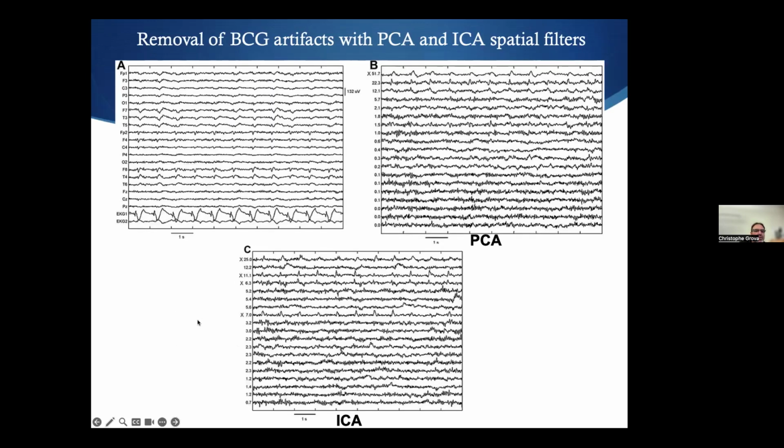And in your ICA, what you see is that this component, this component, this component, and this component is clearly seeing this repetitive rhythmic pattern. So it looks like it was not only one basic component, it was a little bit more, and you can remove those. And this is actually working nicely. Usually, one of the standard techniques we are using is we first use AAS, or OBS, so we first remove most of the artifact. We look at those, and when we realize, looking visually, that it's not so difficult because you see the repetitive pattern, then we add an extra level of ICA.